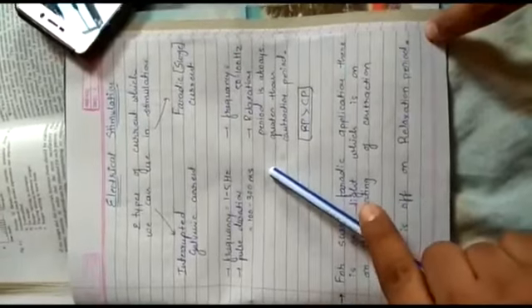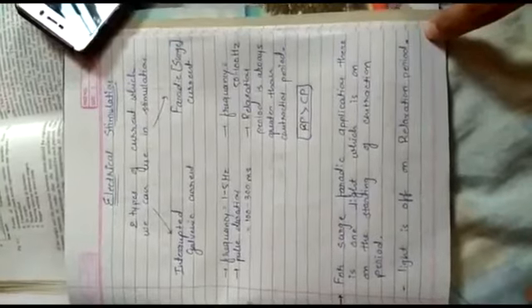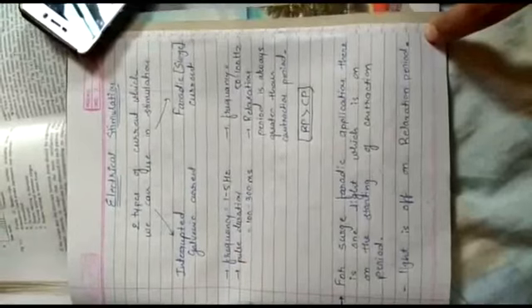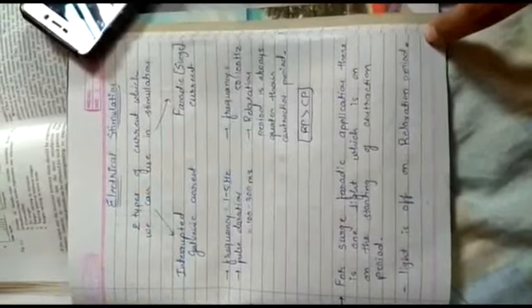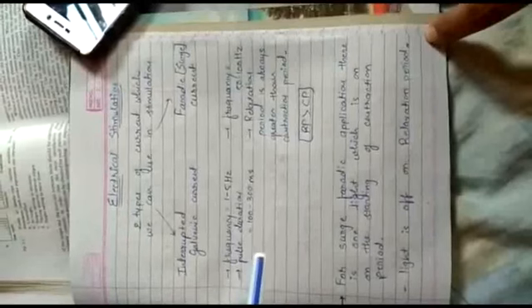In surge Faradic current, we can choose frequency, contraction period and relaxation period. Frequency we can set 50 to 100 Hz, and always set the relaxation period greater than the contraction period. RP is greater than CP.